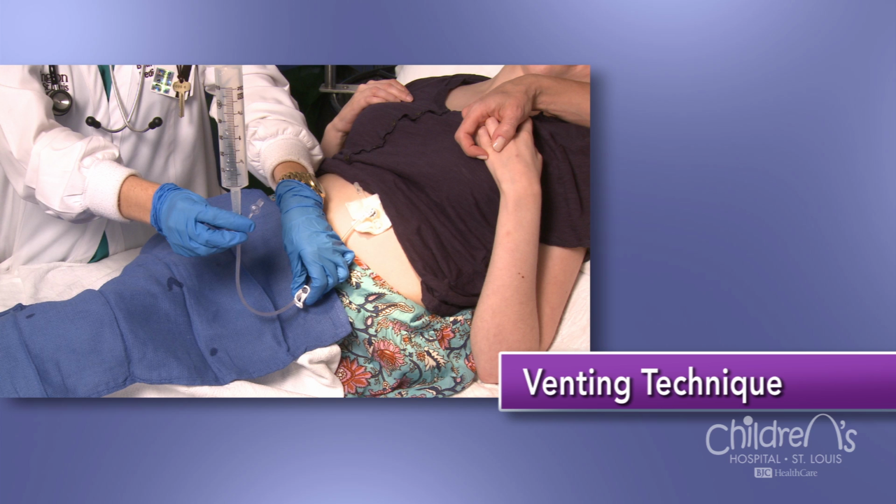Most children who have gastrostomies can burp or pass gas on their own to relieve the excess air in their stomach. However, some children have problems doing this. When this happens, you can help relieve gas from your child's stomach using a venting technique. Follow these steps below to use the venting technique using a syringe.